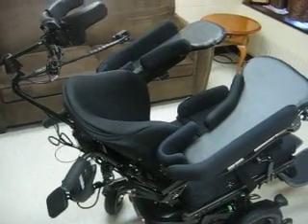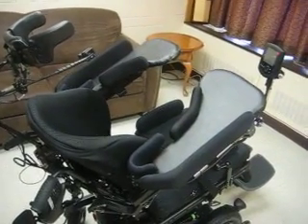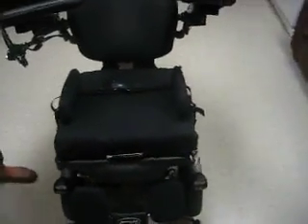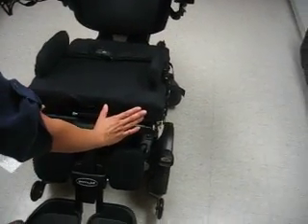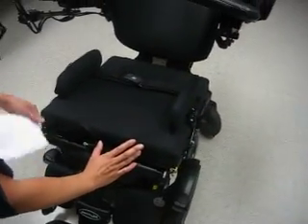Once the patient is positioned in the chair, double check that he is positioned properly. This is the key thing to determine whether he will be able to drive. Some of the things to check for are whether the ASIS are aligned. So you check the hips at the front to make sure there's no obliquity. You check the knees to see if they are even, and if they are not, the patient is rotated in the chair and may need to be repositioned.